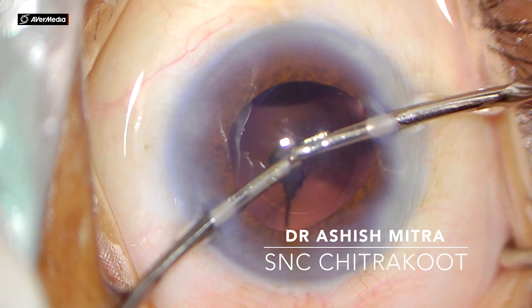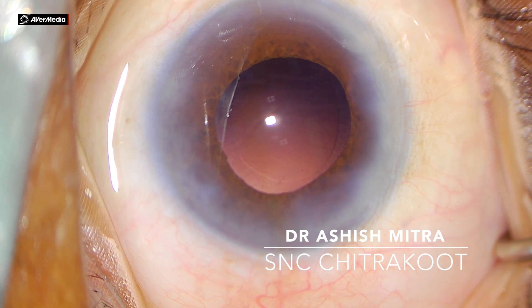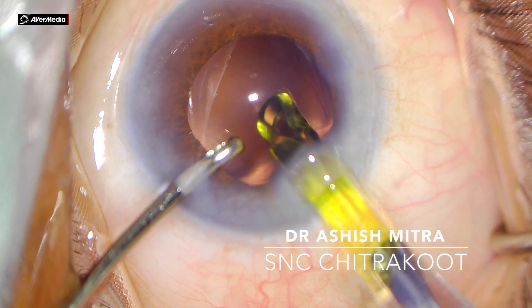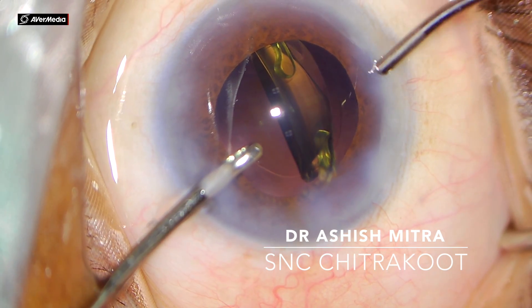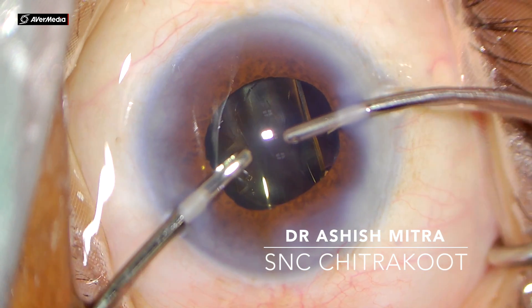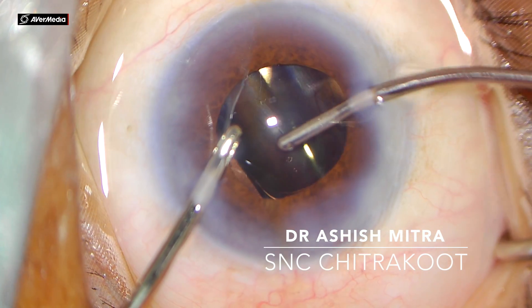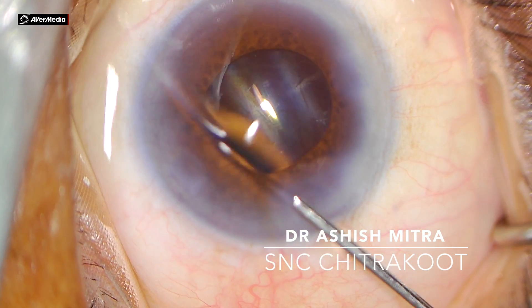Even if there are some fibers or cortical matter attached to the posterior capsule, you might have to polish them. Again with the irrigation cannula in place, I am implanting the IOL under the hydro-implantation technique, which I usually do in all my cases. This is quite advantageous as it is easy to insert the IOL in the bag and there is no need to wash the visco since it is done under saline. This is a hydrophobic IOL and at times it unfolds slowly. The case was completed and finally closure of the wound.